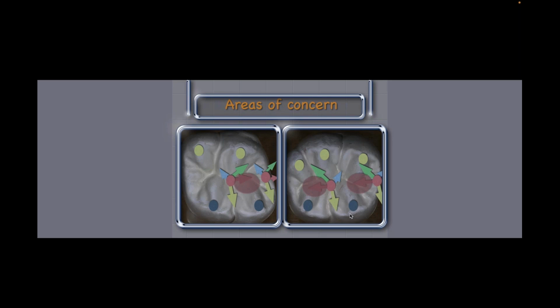Rather than give you an entire occlusal lesson, what I'm really more concerned with is after my centric stop positions, I want to make sure that these areas are not causing problems. I want to make sure that as I'm moving through that cusp tip, I'm not hitting other areas that become basic interferences and cause more challenges for us in the restorative process. And again, your CAD program isn't telling you that. They're only showing you the marks that are under more pressure and the marks that are under less pressure. You're going to get that feel in moving the arches around.